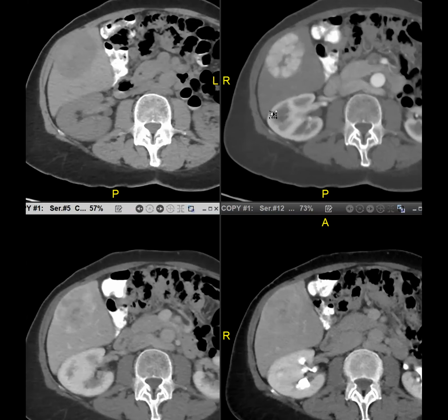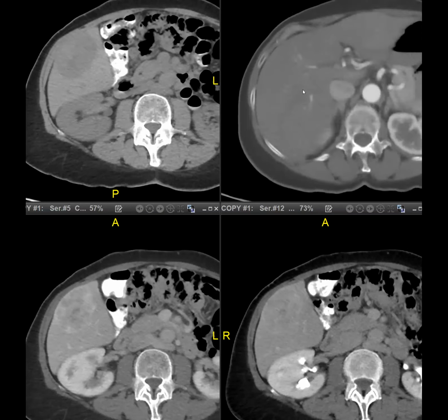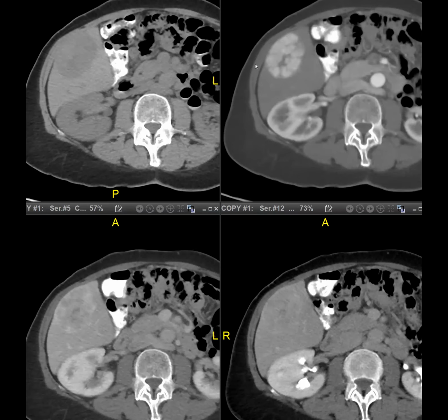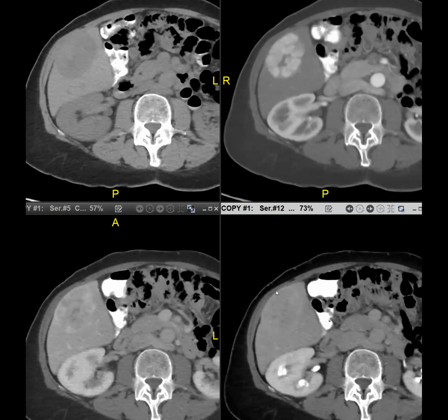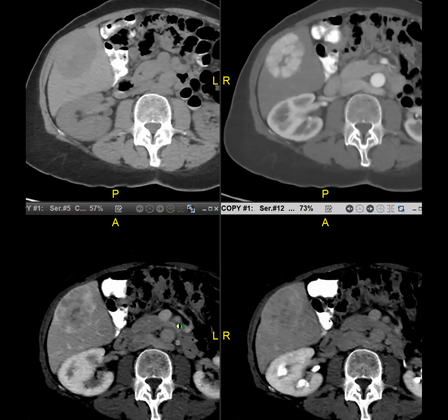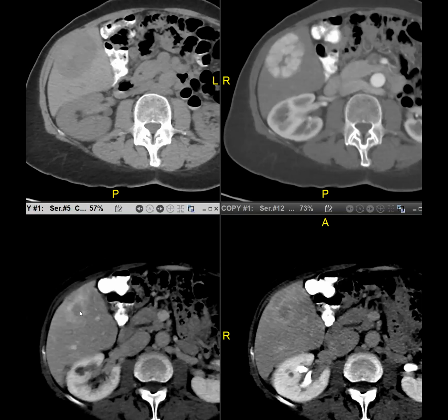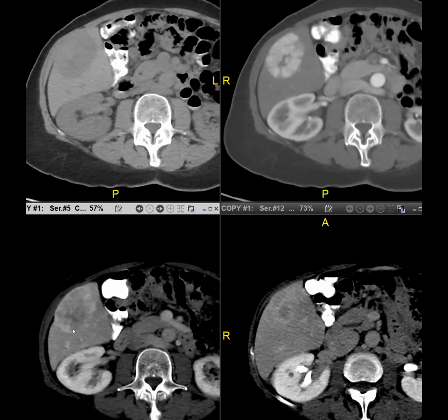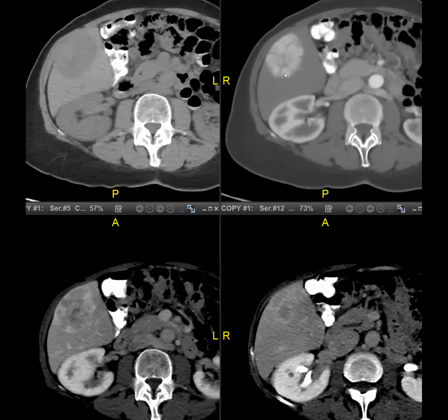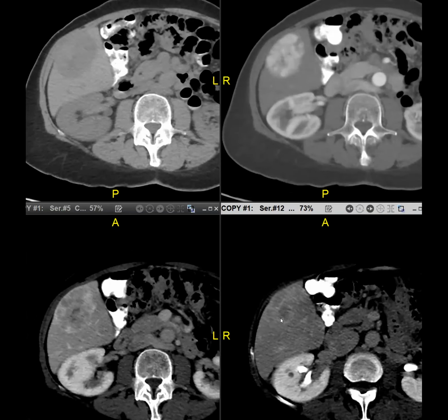All right, liver morphology. The patient has absolutely no prior history of anything. Liver looks normal, right? Given the avid arterial enhancement and isointensity on delayed, my first thought was FNH. Yes, I was thinking the same thing. I still think this is FNH, but how do you not exclude an adenoma? Guys, look, this is enhancing less than parenchyma. This is washout. No, but on the further delayed, is it washing out or not? I would like an MRI to look at it.